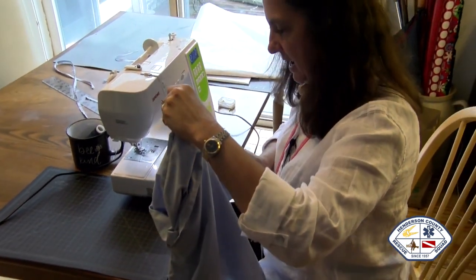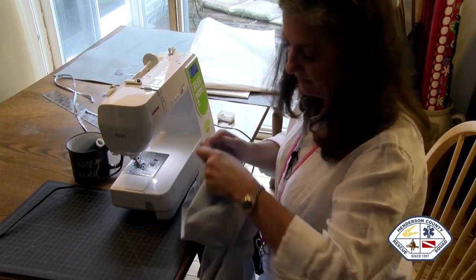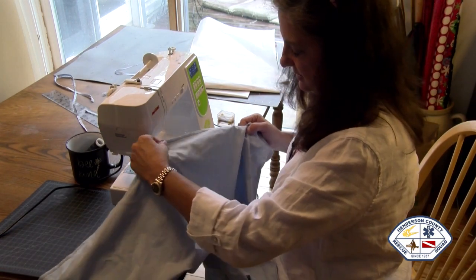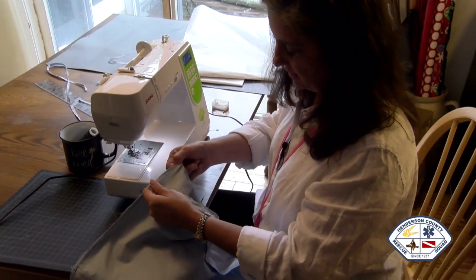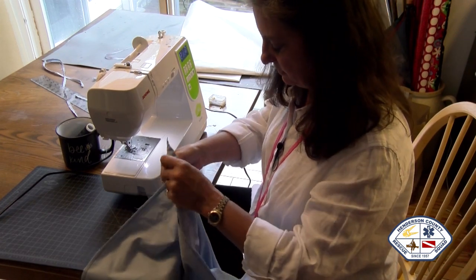Okay, now I've gone through and I've sewn both sides of the sleeve. Let's pull it back out again. I pulled it, put it in. Whoop, there we go. So our sleeve is attached here, our shoulder is attached here, and we've got our leftover piece here, which when I was cutting, I inadvertently cut off. So I sewed it back on. It's not a big deal.